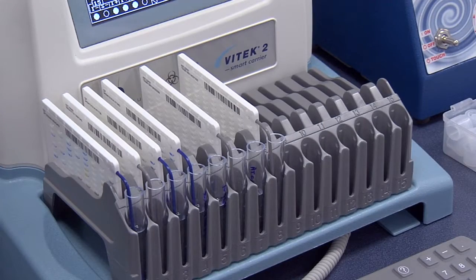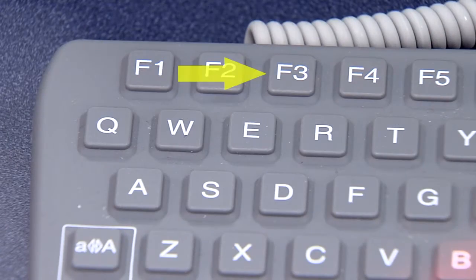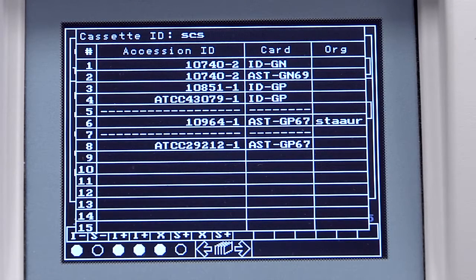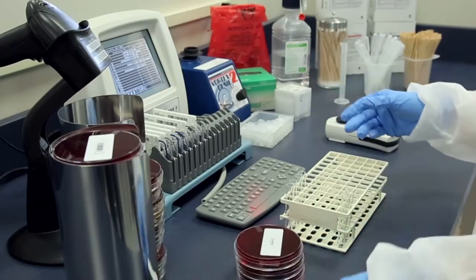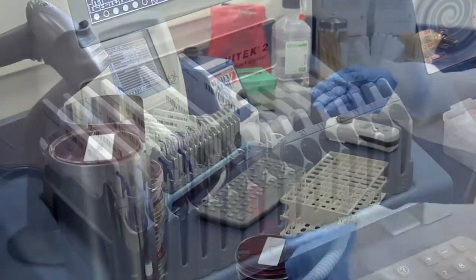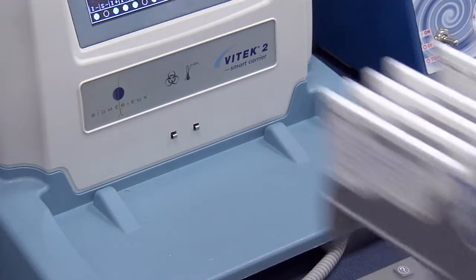Once all inocula and cards are prepared, the F3 function key on the Smart Carrier Station can be used to display a summary of the information recorded on the Button Memory module. It is good practice to verify your work prior to loading cards on the instrument. Remove the cassette from the Smart Carrier Station.